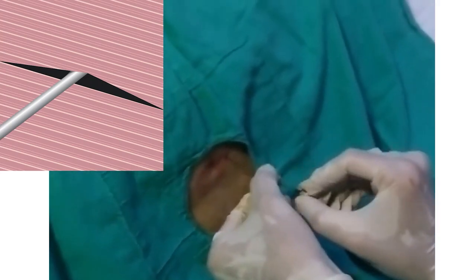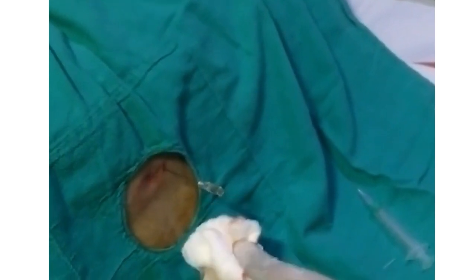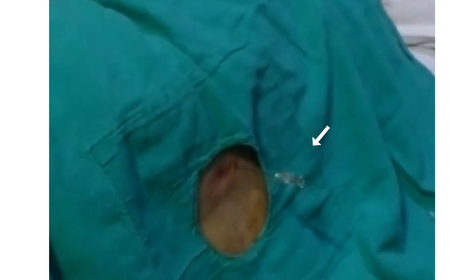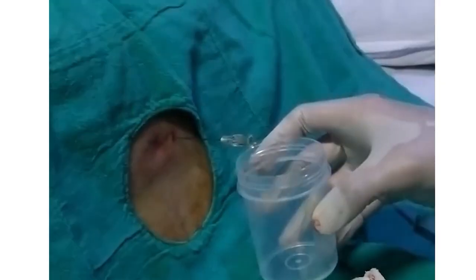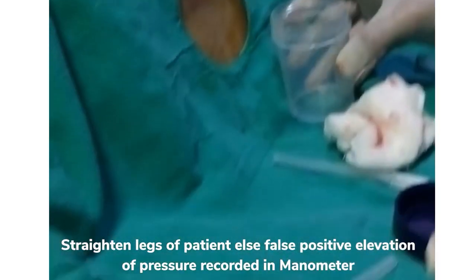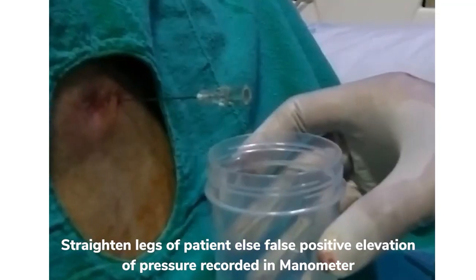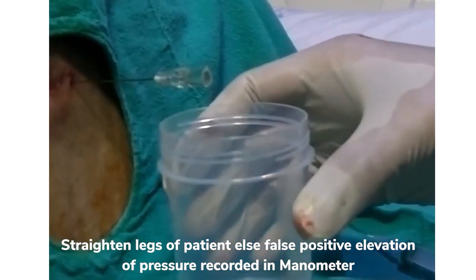If there is no fluid, do not panic. Replace the stylet, advance or slightly withdraw the needle, and you would usually be getting the CSF, as you can see right now. In our case, we had bypassed the step of checking out the opening pressure with a manometer, but in case you are checking out the opening pressure with a manometer, ensure that the legs of the patient are straightened. Else, if the legs of the patient are flexed with the knees touching the chest, there would be a false elevation of the CSF opening pressure.